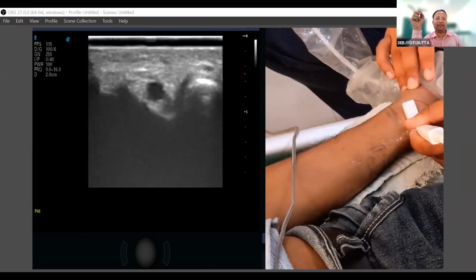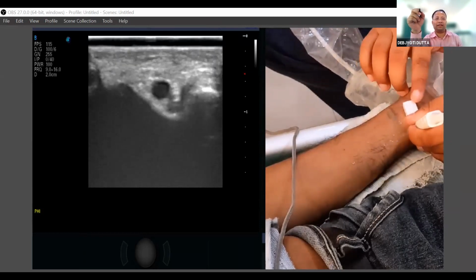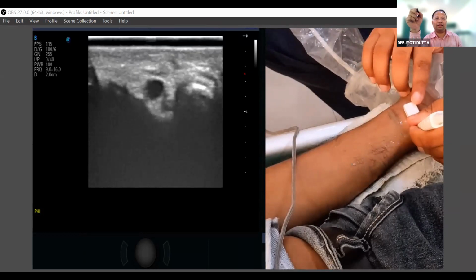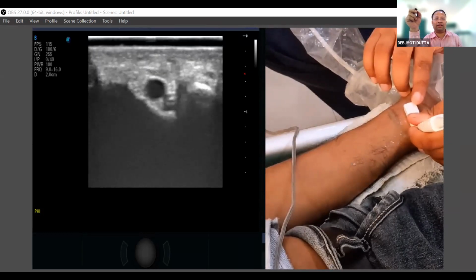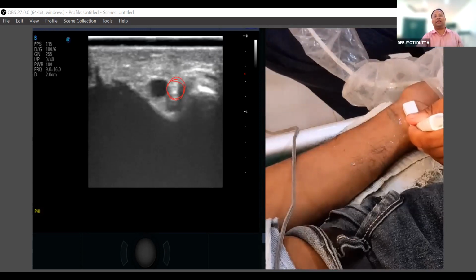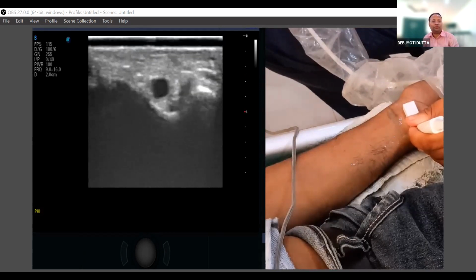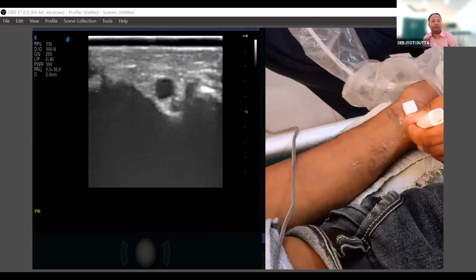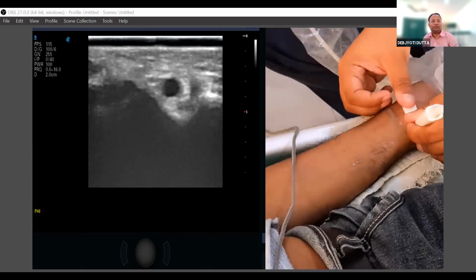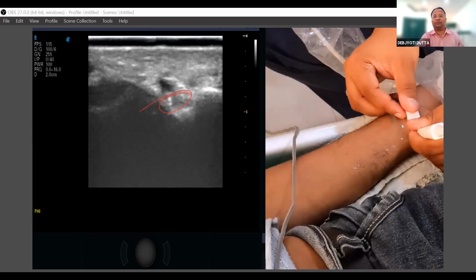Just a minute, let me bring the pisiform into the same view, then I'll check. Okay, so three structures. The nerve is not that clear now. Slight movement, yes. Now you can see it slightly deeper. Increase the focus. Yes. So you can see the pisiform, you can see the nerve, and you can see the ulnar artery as well.